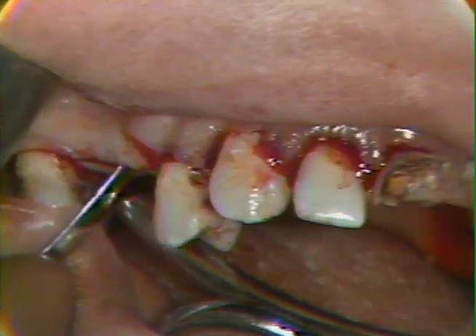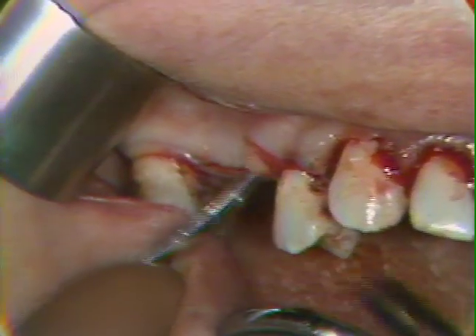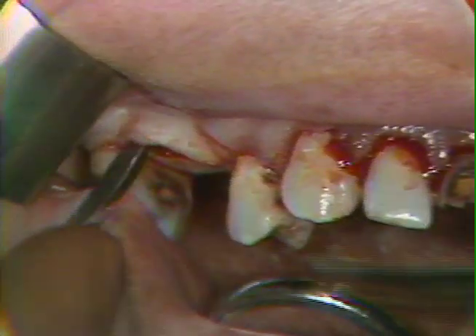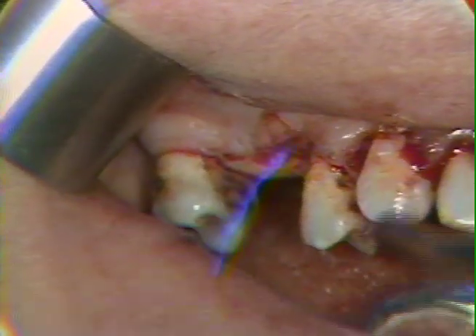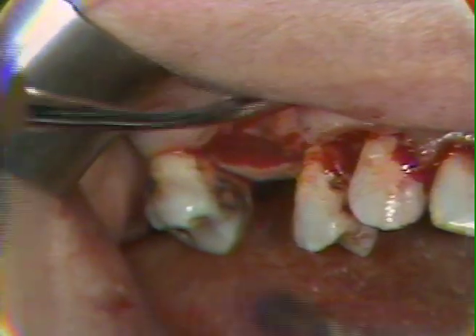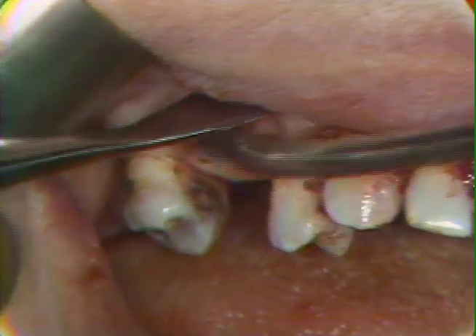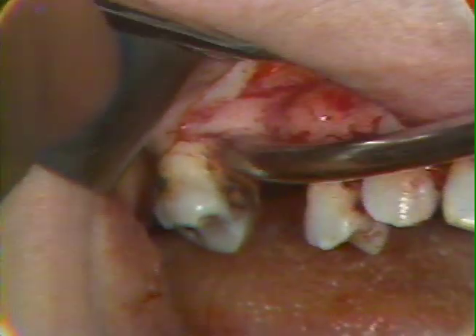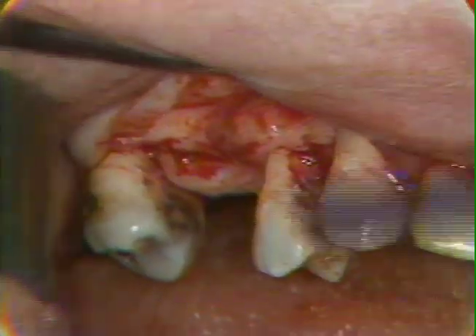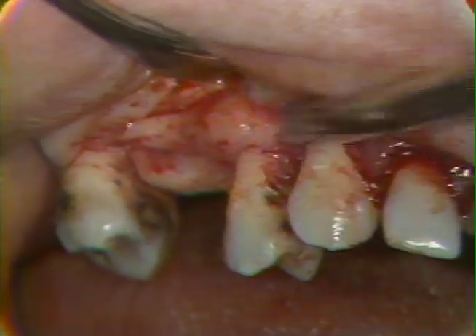Start the flap around the concavities, not over the convexities. If you start over the concavities, you're more apt to be able to strip the periosteum away and not tear it. Whereas if you start on the convexities, it's apt to remain adherent in the valleys that are there. Now, as the flap starts to be reflected, we have a pretty good view of the contour of that buccal plate, how prominent and heavy this bone is.